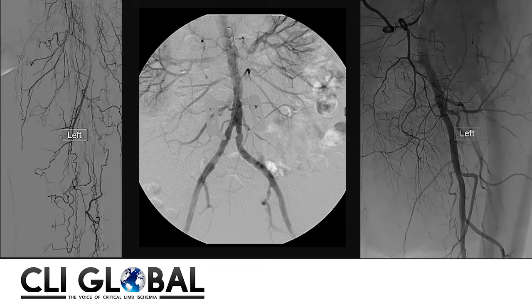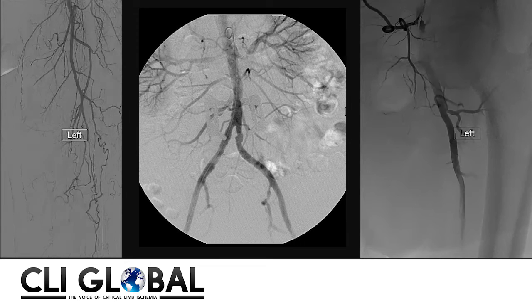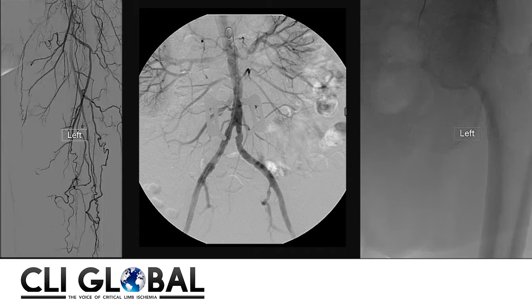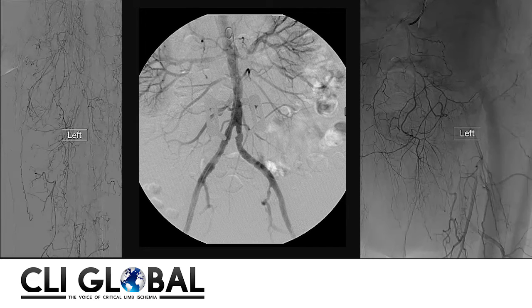This is the diagnostic angiogram that was sent to us from the referring institution. You can see that the patient has some aortoiliac bifurcation disease, and in the right lower corner the SFA is completely occluded. In fact, it appears that the patient's SFA has a high takeoff with a patent Profunda. The diagnostic angiography essentially shows collaterals supplying what appears to be a distal tibial vessel. It is not clear which distal tibial vessel it is — it is possible to be the posterior tibial artery.